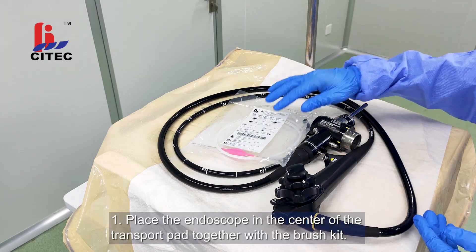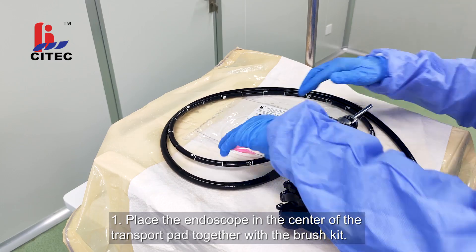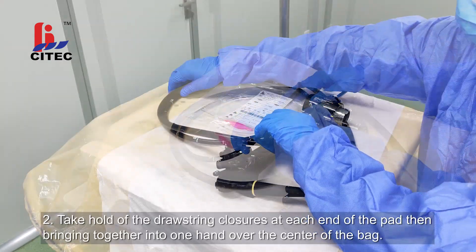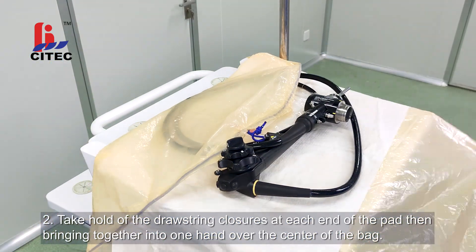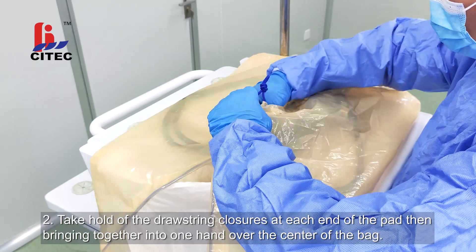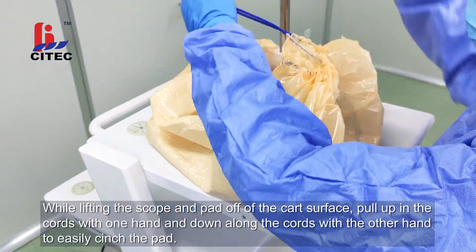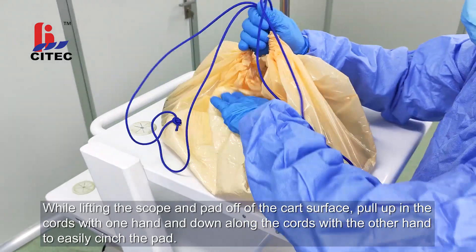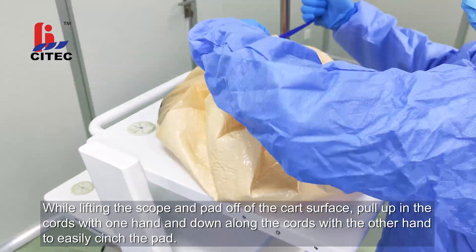Wrapping. Step 1: Place the endoscope in the center of the transport pad together with the brush kit. Step 2: Take hold of the drawstring closures at each end of the pad, then bring together into one hand over the center of the bag. While lifting the scope and pad off the cart surface, pull up the cords with one hand and down along the cords with the other hand to easily cinch the pad.